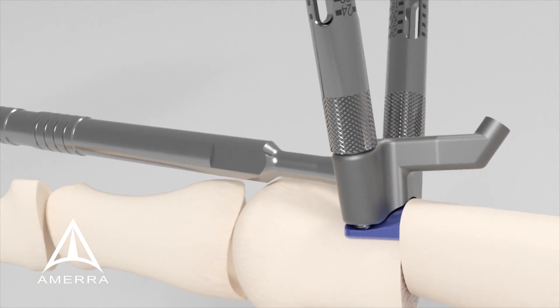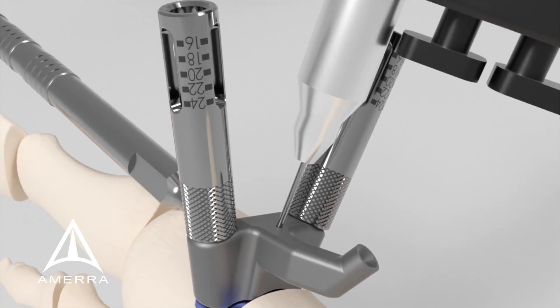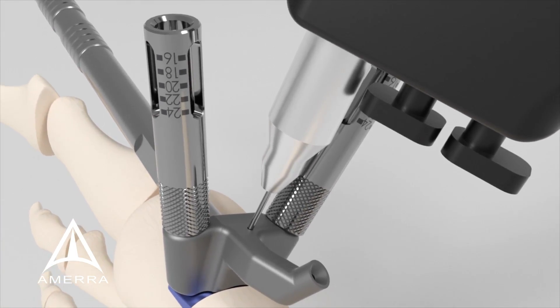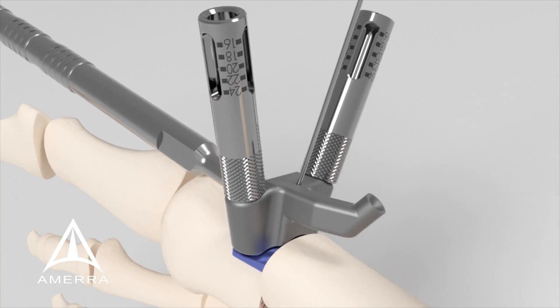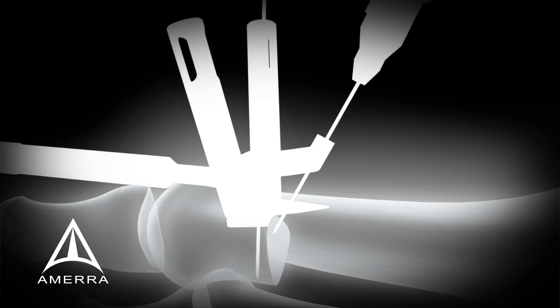Temporarily secure placement utilizing two K wires inserted into the correct length through the wire guide holes in the assembly. The distal K wire holds the placement guide in position while the proximal K wire will be used for the cannulated screw.